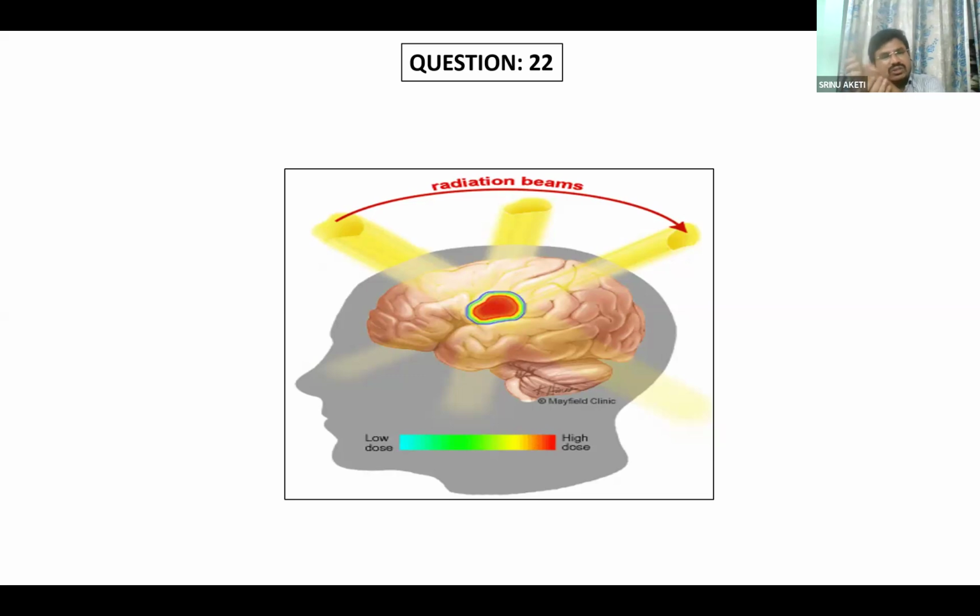Okay. Planning wise, any difference? As you said, you are using non-coplanar beams. Why do you want to use non-coplanar? Because we are using different pencil beams, sir, so the dose to the adjacent normal tissues is reduced, and with multiple pencil beams many angles are possible with non-coplanar beams. Why do you want that many? To reduce the normal tissue dose, sir. Your dose per fraction is very high, so you need to distribute the entire dose over a larger area, not in one side. So you give multiple beam directions and spread the dose across different angles, reducing the normal tissue fractional dose.